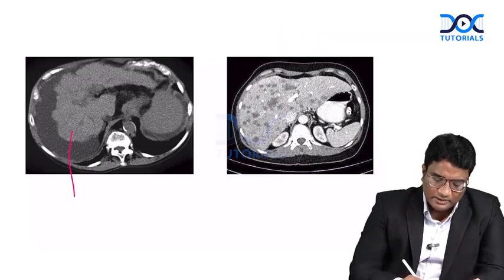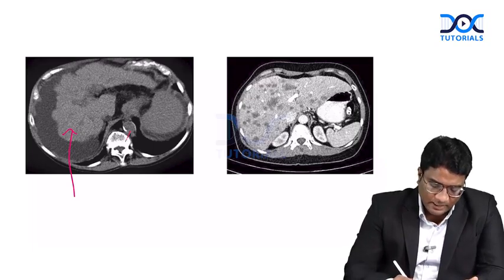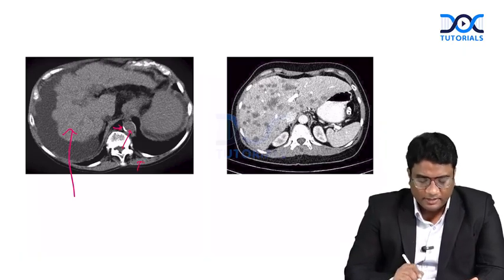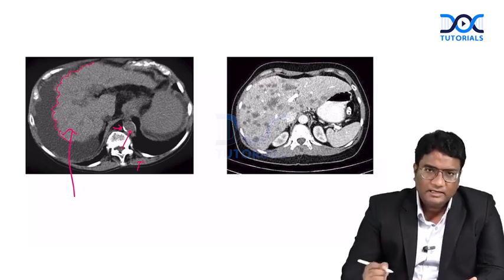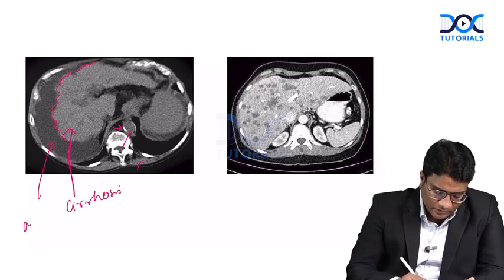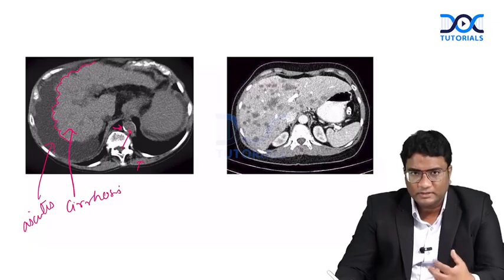And please look at this CT of the liver. Now this is a plain CT scan. You can see the aorta not having contrast. It is similar to the surrounding muscle. There is some wall calcification, but the aorta is not having contrast. Look at the liver. The liver shows a lot of irregular nodularity. This is suggestive of cirrhosis of liver. And you can see the surrounding fluid also. There is ascites in the patient also. That is how the CT scan would show cirrhosis and ascites.